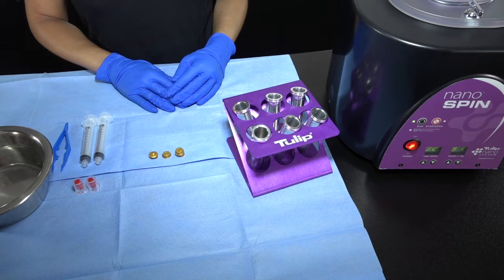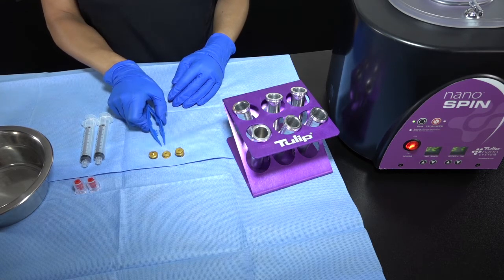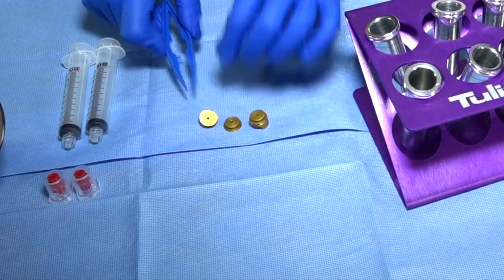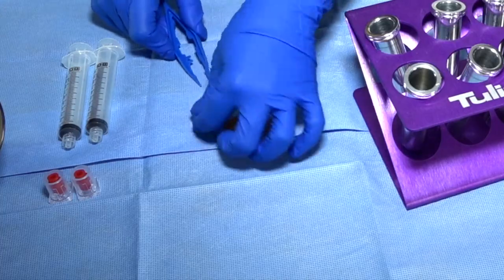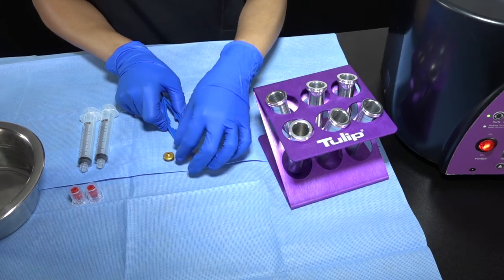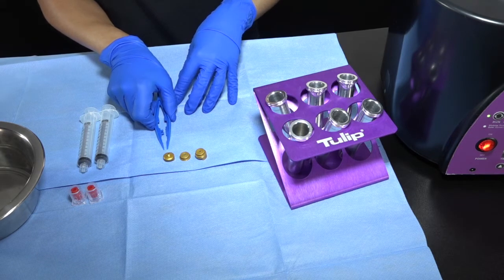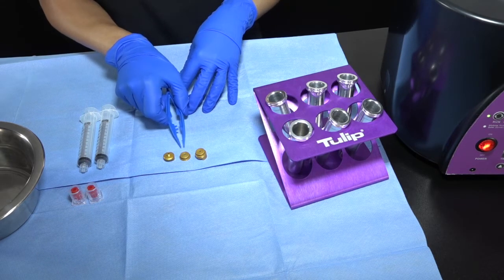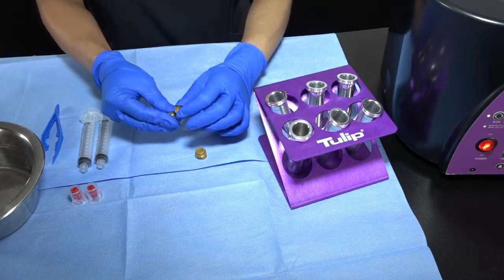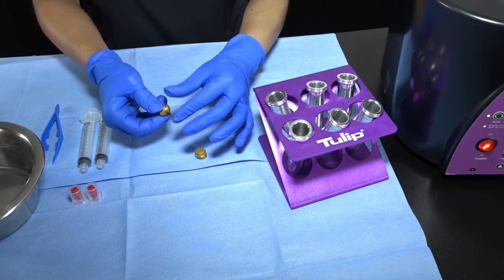Now let's take a closer look at the patented Tulip crowns. The crowns consist of a base which has a U shape at the bottom, and the head looks like a top hat. The crowns need to be sterilized before use and should always be sterilized separately.